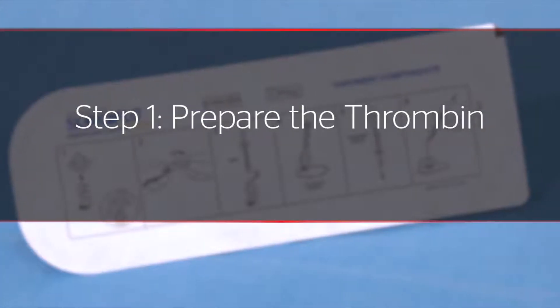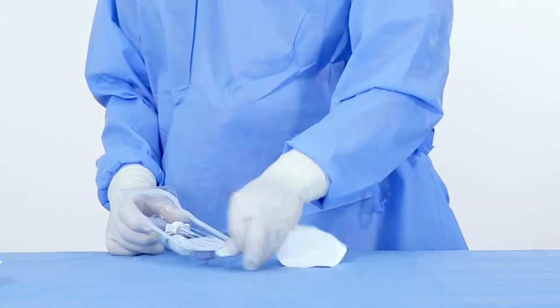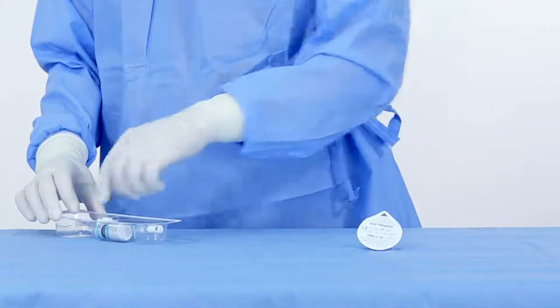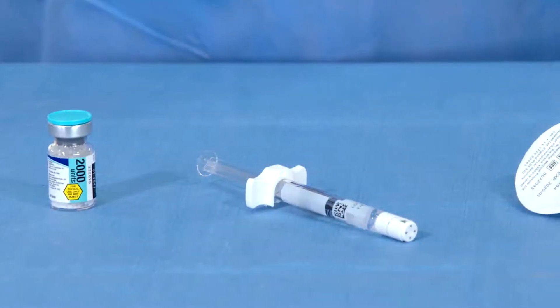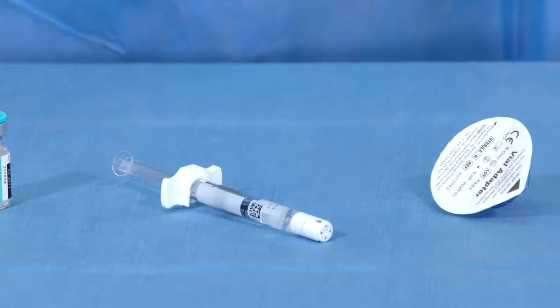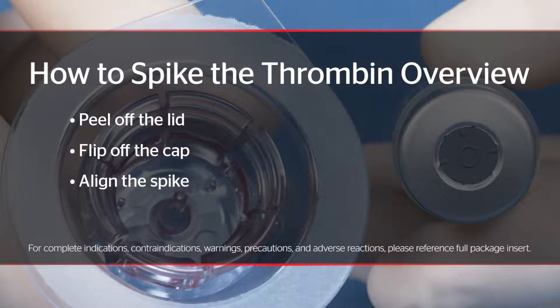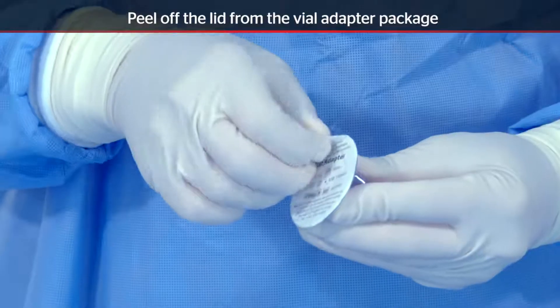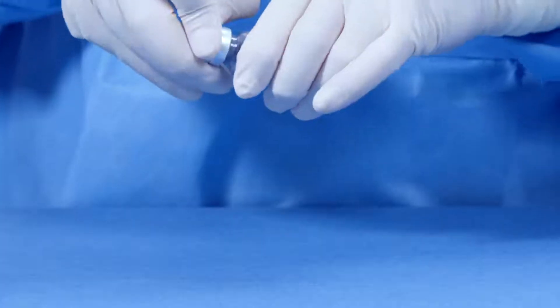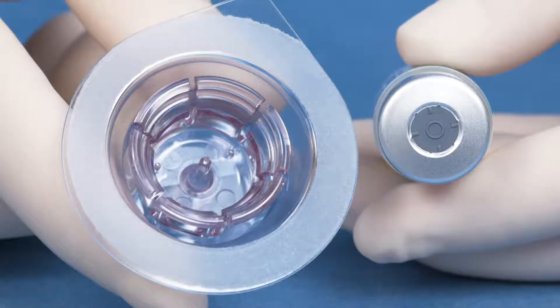Step one: prepare the thrombin. Peel back the Tyvek lid and remove the vial adapter, needle-free syringe, and thrombin vial. You are now ready to attach the vial adapter to the thrombin vial. To spike the thrombin properly: peel off the lid, flip off the cap, align the spike, and press the adapter straight down with four fingers. Peel off the lid from the vial adapter package, flip off the cap from the thrombin vial, and place the vial on a flat surface.